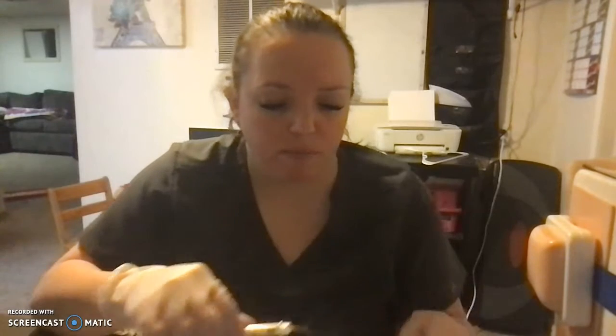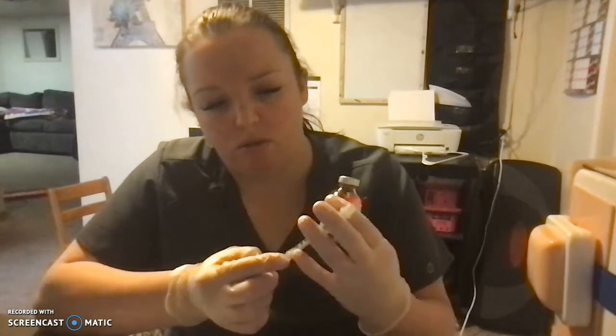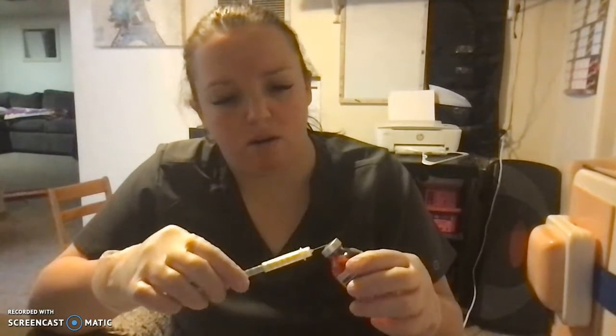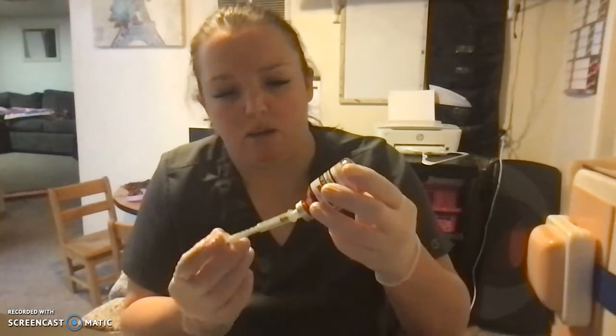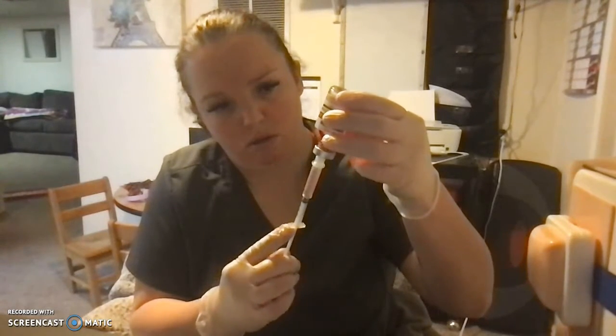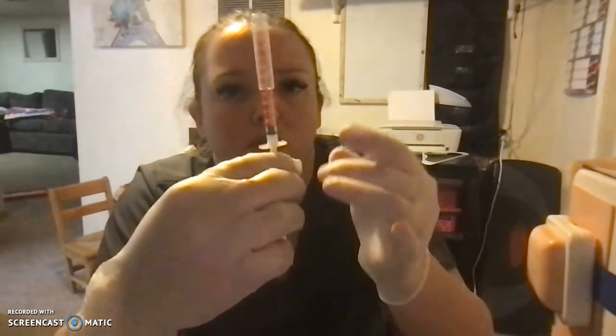Open up my needle. So like I said, I'm going to do 1,000 units. So 1,000 units out of this, because this is 10,000 units per 10 mLs, I'm going to do 1 ml. I only need 1,000 units. So I would pull back the air, inject that into my bottle, and then I would pull back. One ml. So there is 1 ml. Make sure that there's no air bubbles, of course.